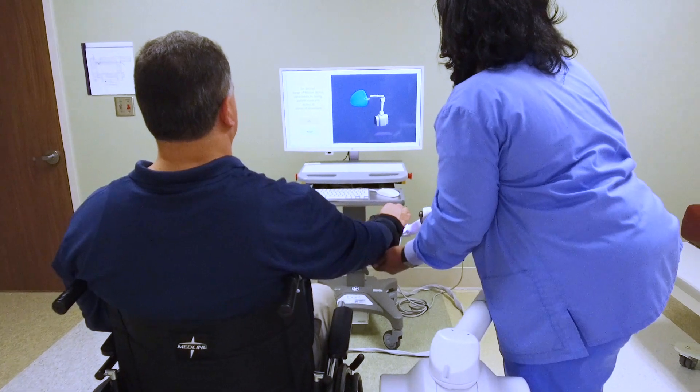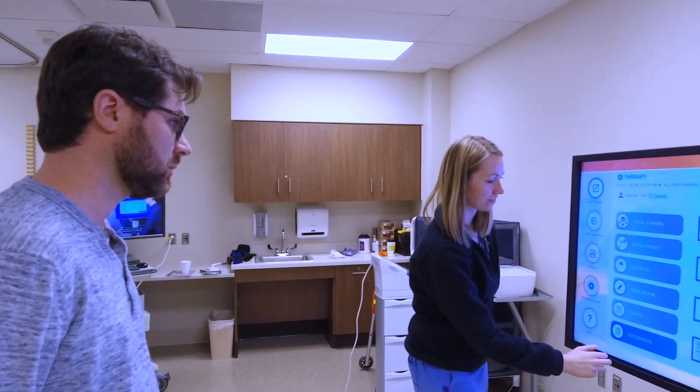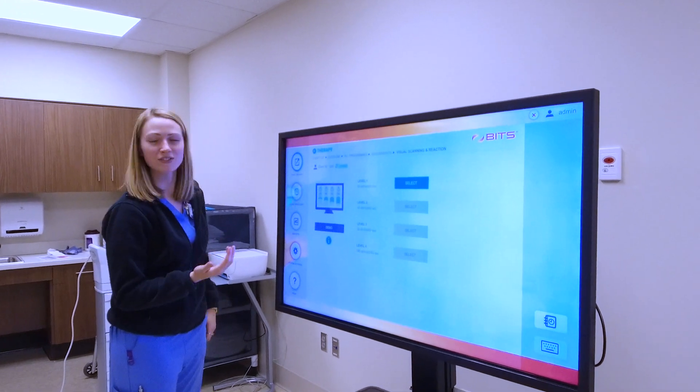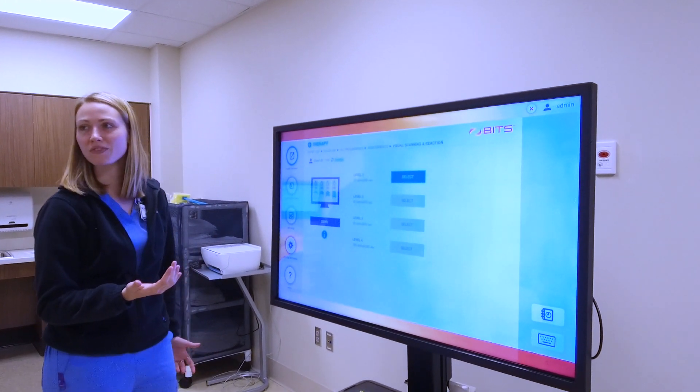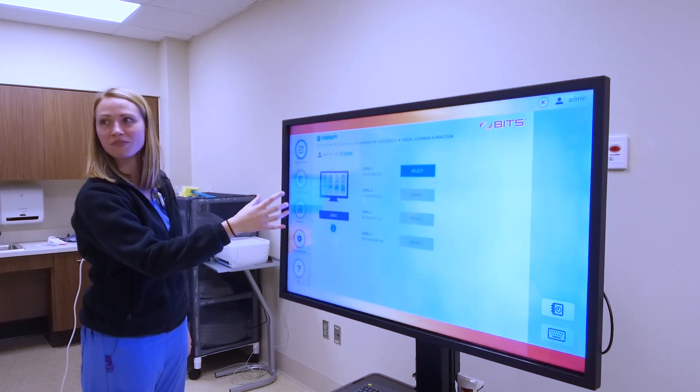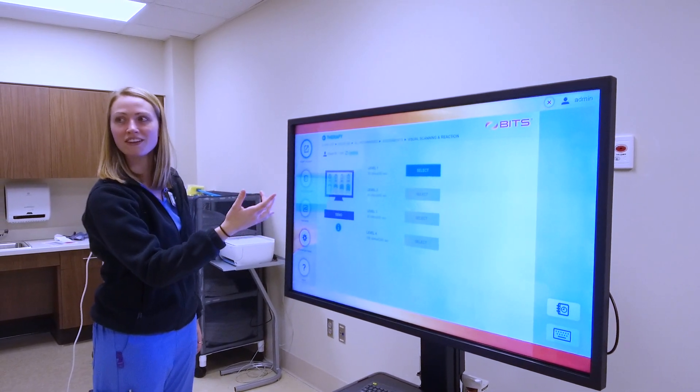The BITS is a device that can be used by all disciplines — occupational therapists, physical therapists, and speech therapists all utilize it in their treatment sessions. It can be used for standing and working on reaching outside of their base of support, upper extremity strengthening, reaching upwards outside of their base of support, and working on visual scanning and some cognitive tasks as well.